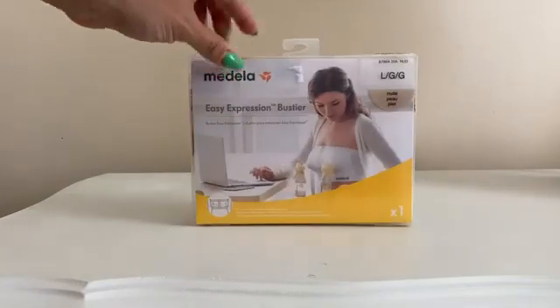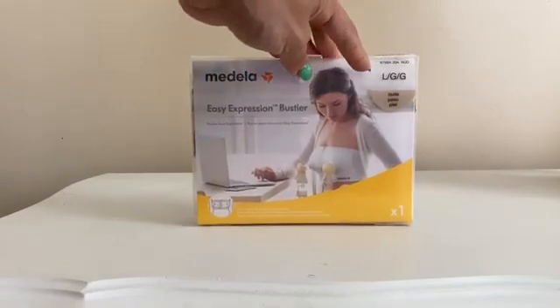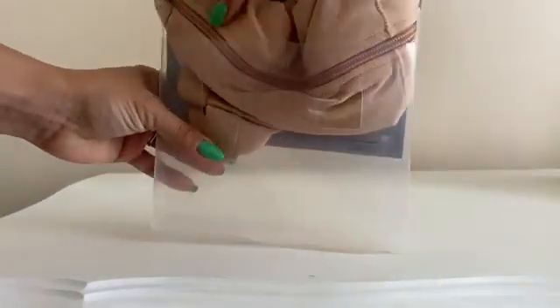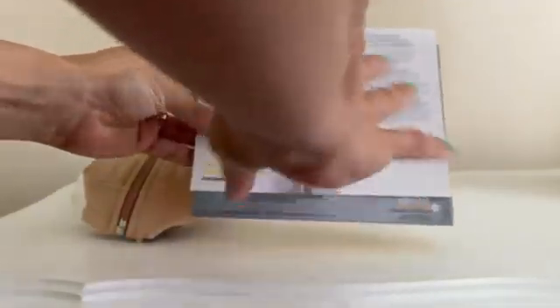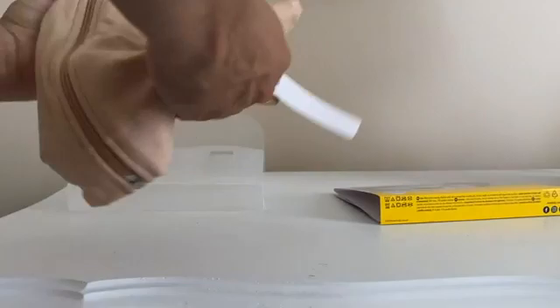Here is the Medela Easy Expression Bustier. I got it in the color nude in size large. It comes in this package, you just open right here, and it comes with the bustier and also some paperwork and instructions on how to use it and the different sizes.